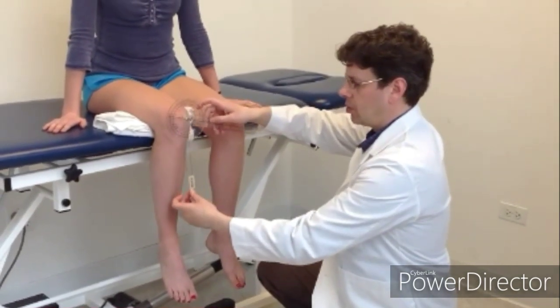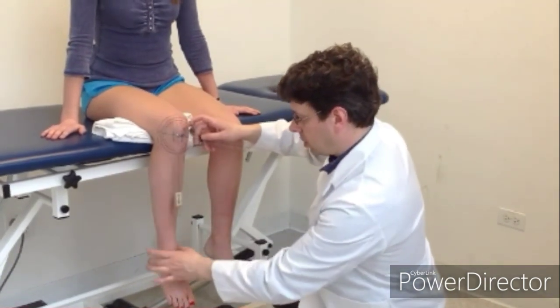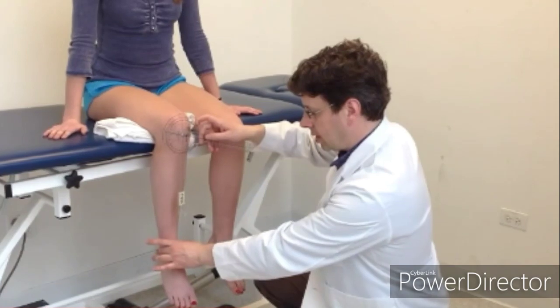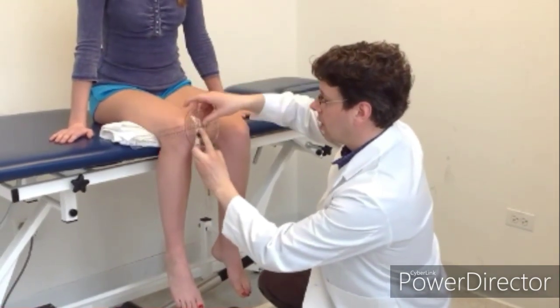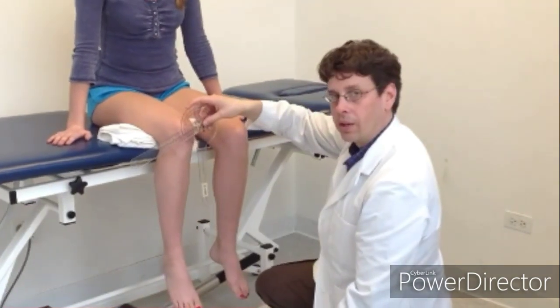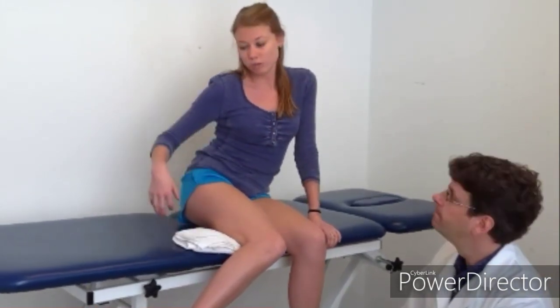We'll be positioning the axis on the anterior surface of the patella. The stationary arm will be perpendicular to the floor, and I'm going to point it between the lateral and medial malleoli. And the movable arm will move with Kelsey's leg, as so. You should be aware that if your patient lacks hip internal rotation, they will try to compensate by leaning their trunk, by tilting their pelvis and raising their hip, or attempting to raise their knee.